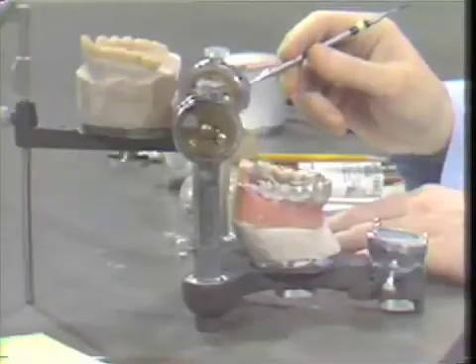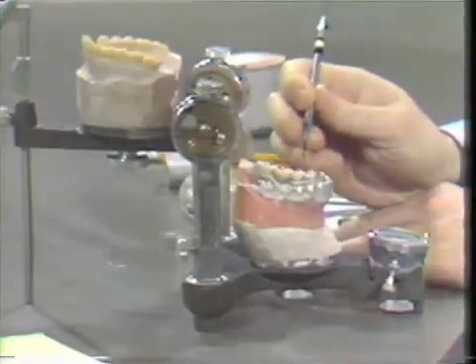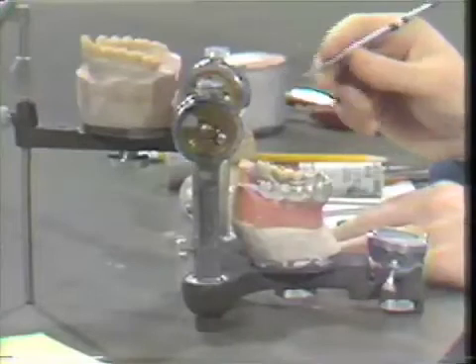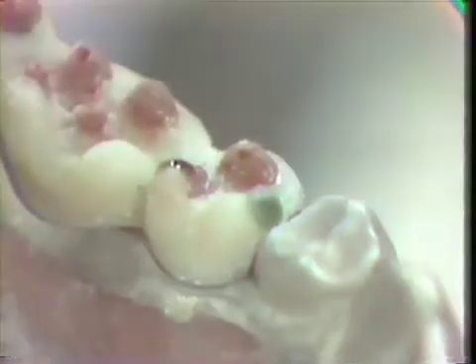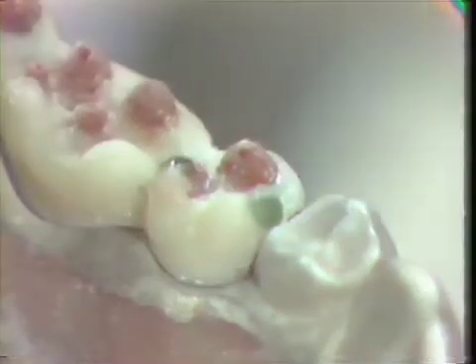We're using a green wax called Neal's wax. It's a very nice wax to work with. And we'll begin developing the marginal ridge areas on our wax pattern. This has been called the fish mouth part of the procedure.